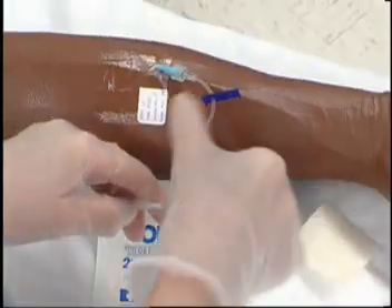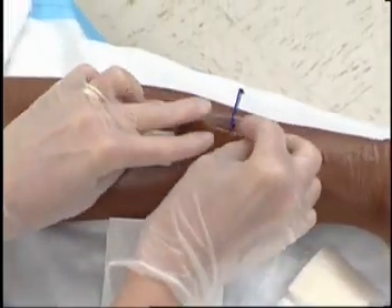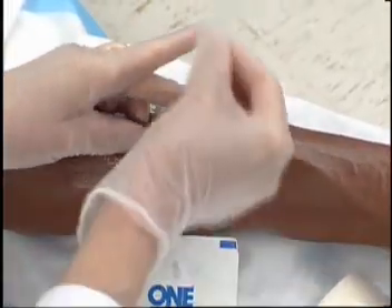If the lock does not have a clamp, simultaneously remove the syringe while completing the flush.